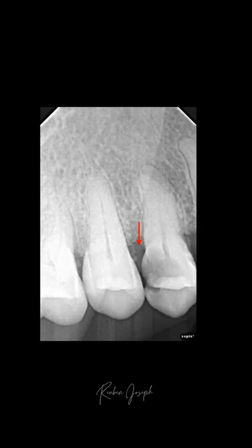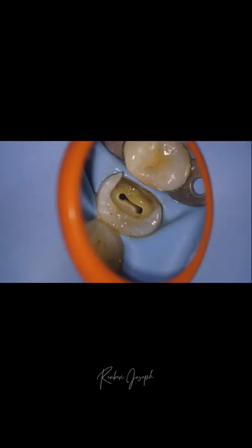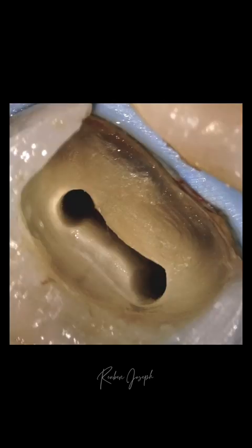This is just the typical deep proximal cavity. We can definitely expect the margin of the cavity to go well below the gingiva here. In this case, I've used a cautery machine to do some amount of gingivectomy to elevate the deep margin of the tooth above the gingival level. And that's the tooth isolated. Whenever it comes to multiple teeth isolation, I always prefer a latex-free heavy rubber dam. This is just a magnified image of the previous picture to show you the control I have over the workspace once the rubber dam has been placed and inverted well below the margin of the tooth.